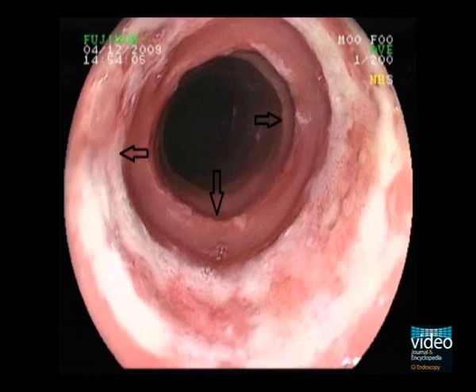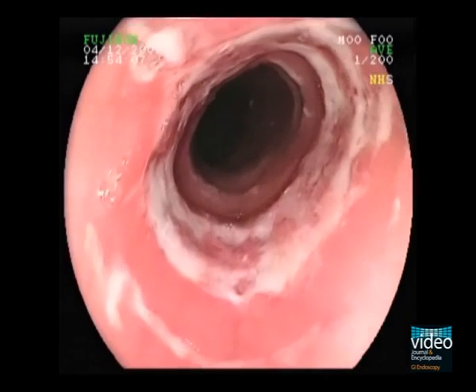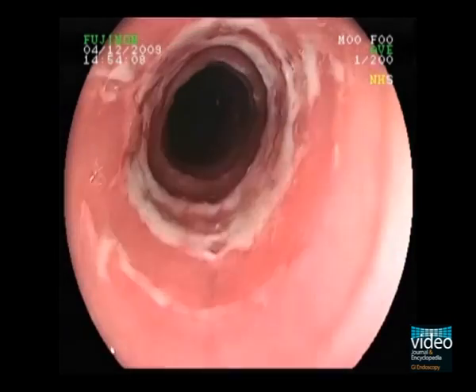The third typical feature of eosinophilic esophagitis are circular rings, as seen here in the proximal esophagus. The whitish surface of the ring suggests that this was the site of the food impaction.